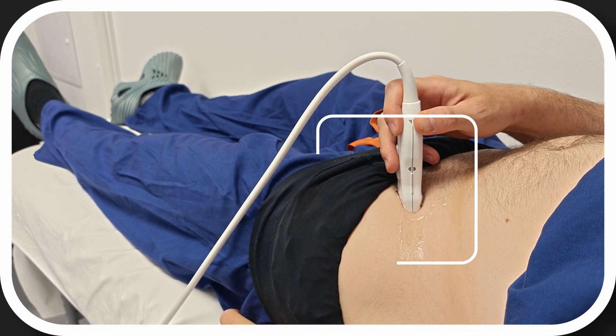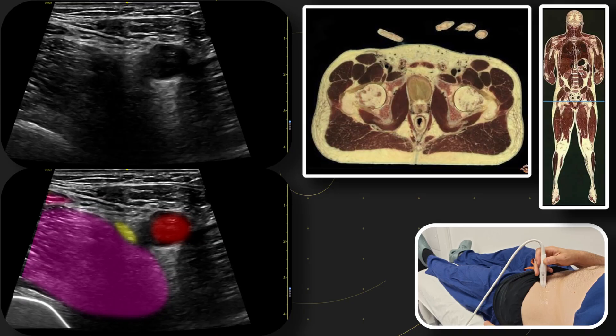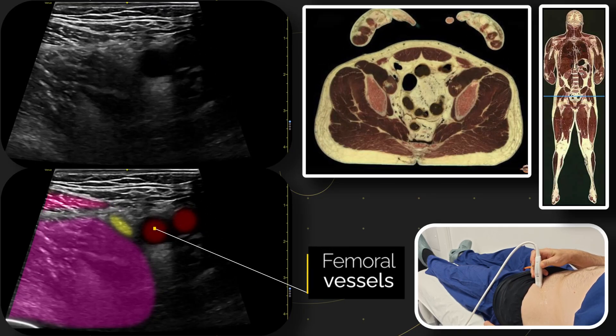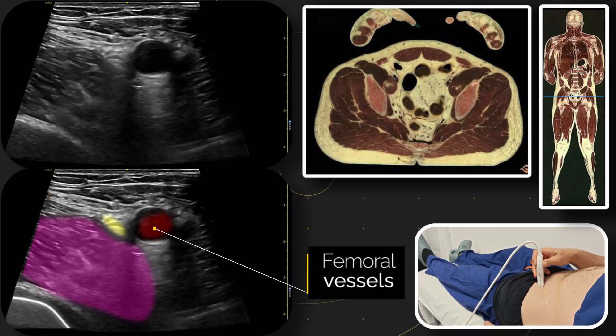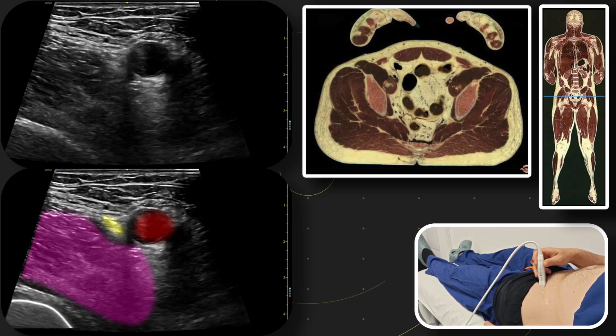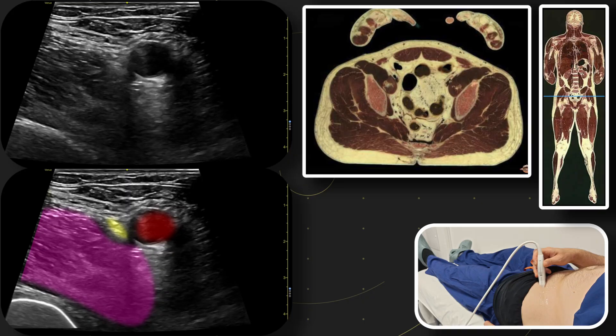Our first landmark we need to find is the femoral artery. We want to make sure this is the common femoral artery, and we'll do this by scanning cephalad and caudad — up and down — so we can see the bifurcation of the superficial femoral and deep femoral arteries. Here we can see the common femoral artery splitting out to superficial and deep.